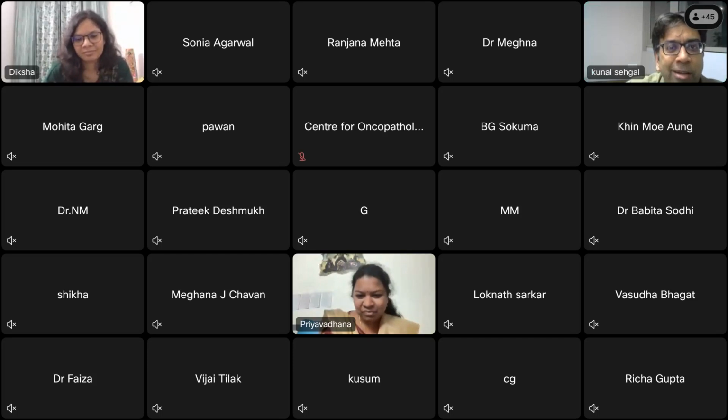If you're seeing the slide, there is some reason the slide has been made. You need to know that, and your staff needs to know that. It's not only training the pathologist; the CBC machine staff should know why the slide was made. In our lab, it is a rule that when they send a slide, they put a small comment on the sticker, on the slide, or on the paper. Low HB, they put an arrow, HB low, platelet low. One or two things they'll write, or they'll send a printout to us. This gives us the confidence that they know why the slide has been made. So the journey starts from there, and I would encourage all pathologists to see CBC values, histograms, and flags without fail.